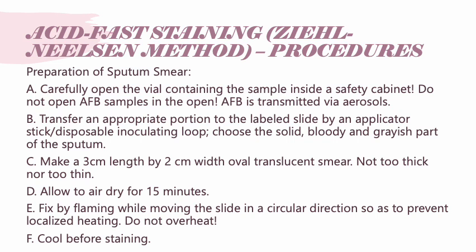First, carefully open the vial containing the sample inside a safety cabinet. Do not open AFB samples in the open, as AFB is transmitted via aerosol. Now, transfer an appropriate portion to the labeled slide using an applicator stick or disposable inoculating loop, and choose the solid, bloody, and grayish part of the sputum.